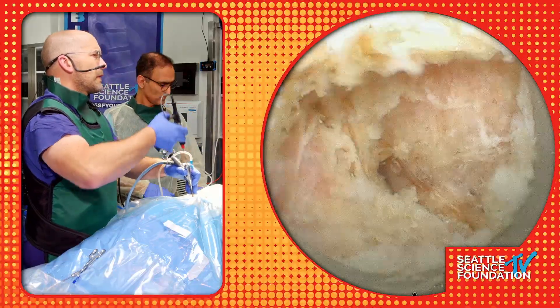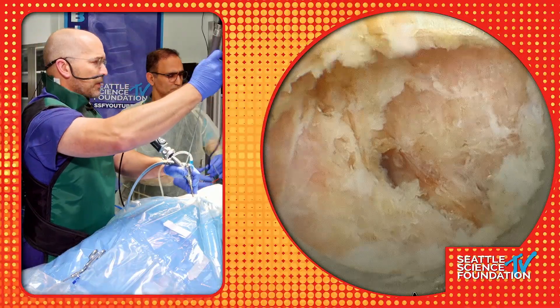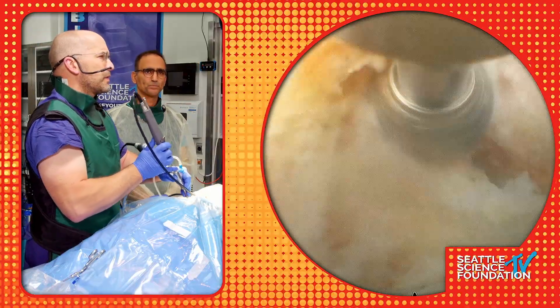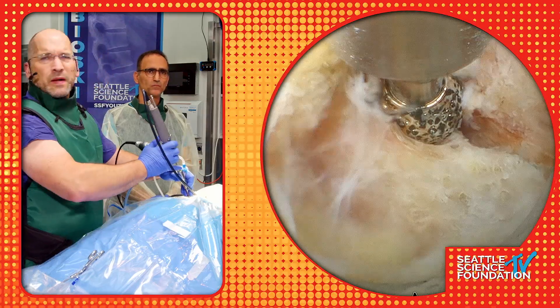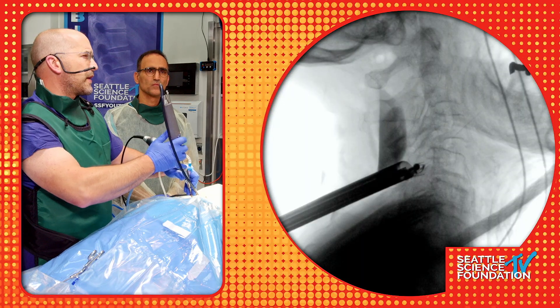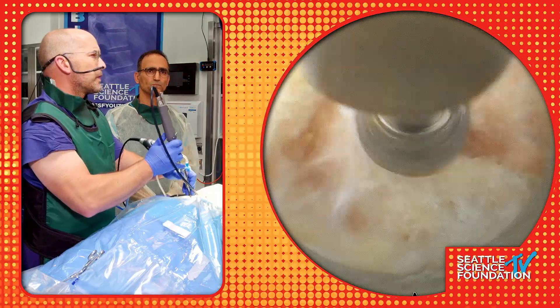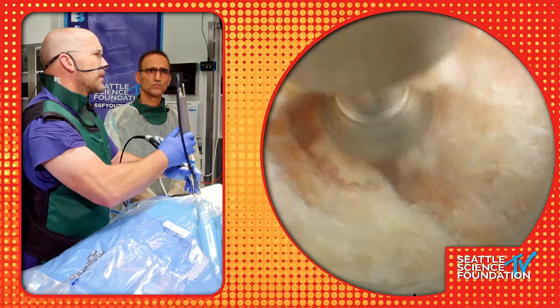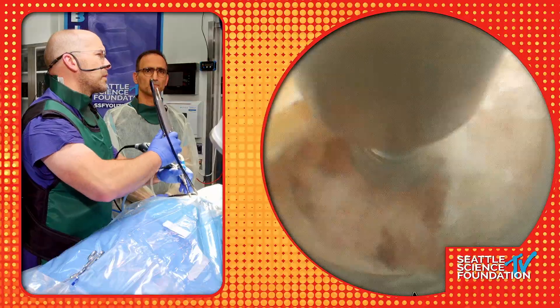Drill please. Before we take the x-ray out, I always like to leave a mark to make sure the drilling is just right — a little mark on the lamina of C4. X-ray confirms we are right at C4, everybody agrees — at C4-5 at the superior lamina. We can bring the x-ray out and start doing a small hemi-laminotomy.